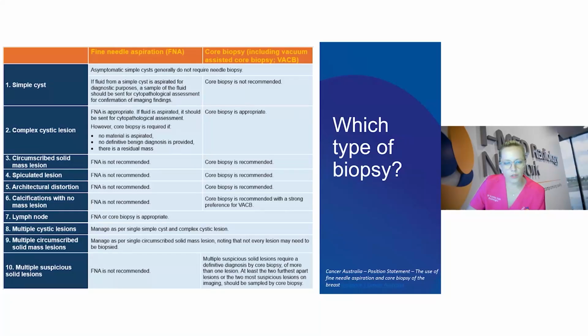From our point of view, we always send for cytological analysis if we aspirate a lesion, and that is to satisfy Medicare most of the time. And because once you've taken it, the recommendation is that we confirm that it is a benign lesion. So everything else, we don't recommend FNA. Lymph nodes, there is mixed practice. I try to core biopsy as many lymph nodes as I can. I find I have fewer surgical upgrades at sentinel lymph node if I've cored the lymph node before operation.